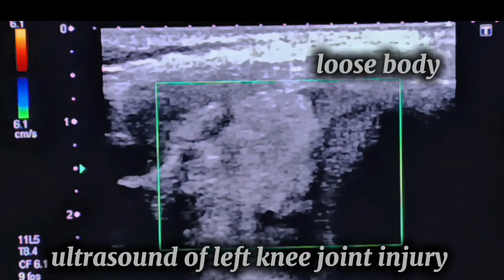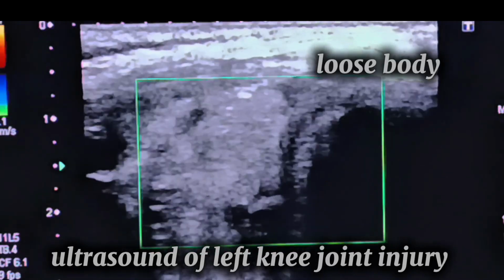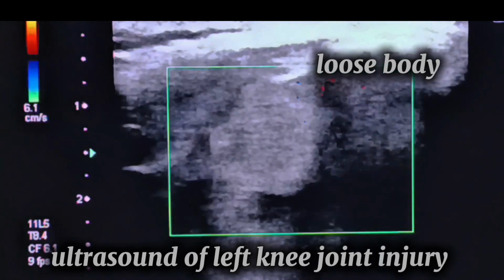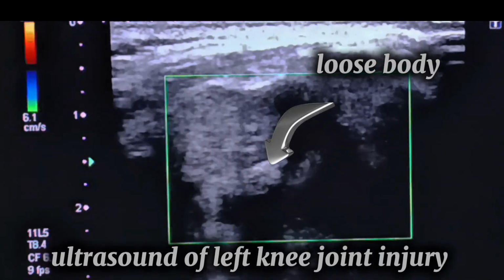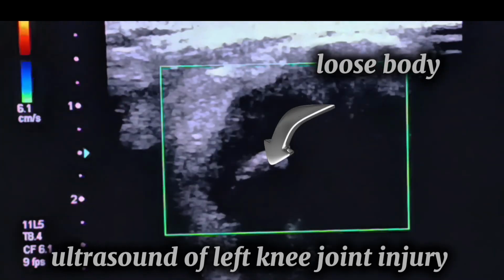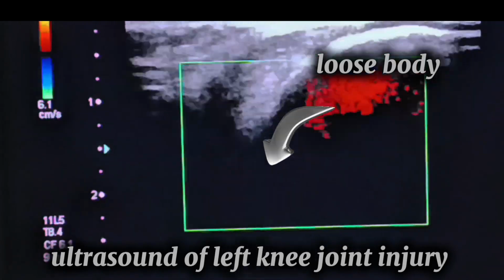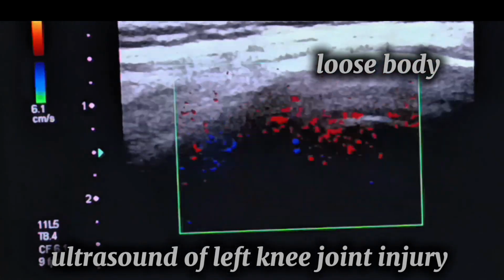Moderate anechoic to hypoechoic effusion is noted, distending the lateral patellar recess. Fluid surrounds the loose body, confirming intra-articular pathology. No septations or complex findings were seen. Intra-articular echogenic loose body in the lateral compartment of the left knee was likely post-traumatic osteochondral fragment due to prior trauma.